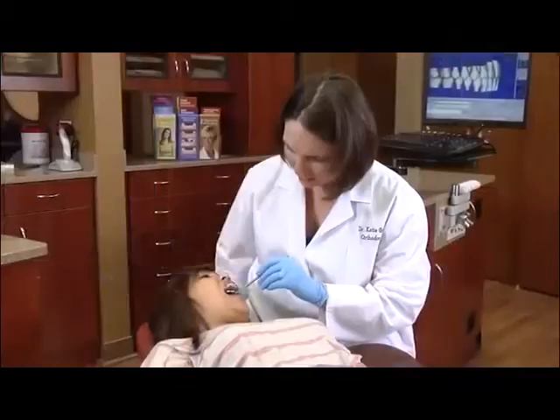Patients should know that a TAD and the gum tissue around it needs to be kept very clean. If it is not kept clean, the gums can get inflamed and an infection may develop. Infected and inflamed gum and bone tissue can weaken the TAD, and it may need to be removed. A TAD may also come loose over time. Remember, it is a temporary implant that may lose its solid feel and need to be replaced.